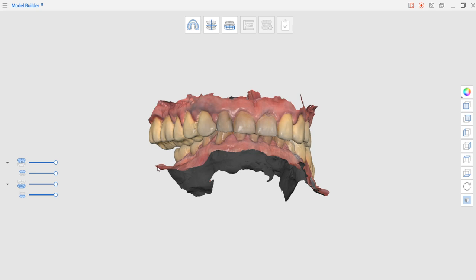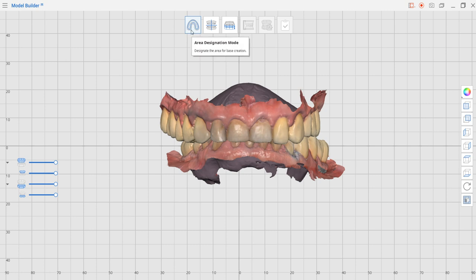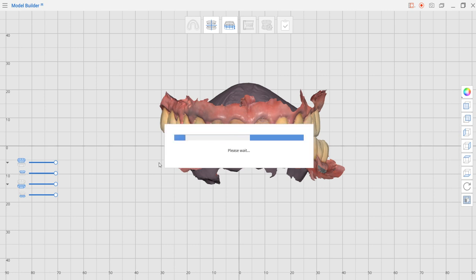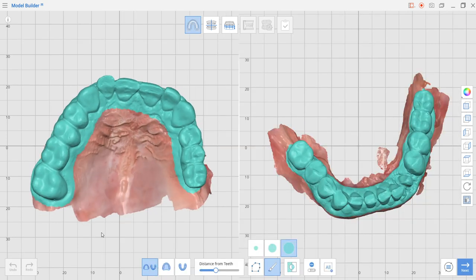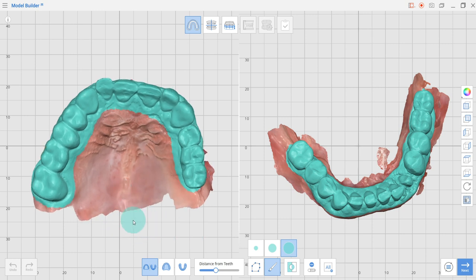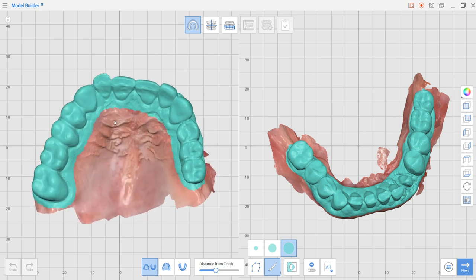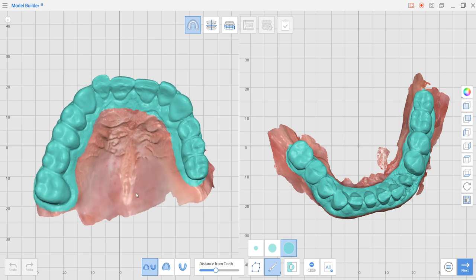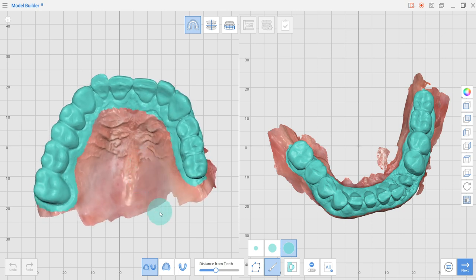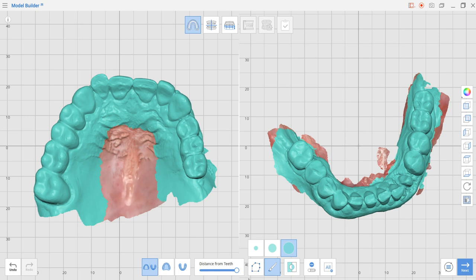I'm going to hit confirm and start building the model. We're just going to press on the upper left first icon of area designation. This is going to open the first step where you can see both models already selected in a double view, and also the area that model builder will use to generate the models is selected in green. We can expand or lessen this area by dragging the slider.